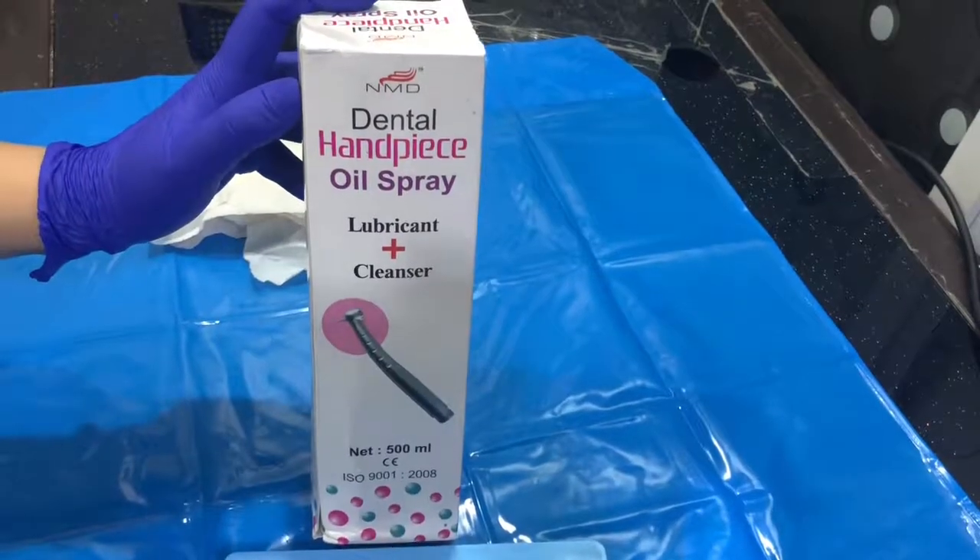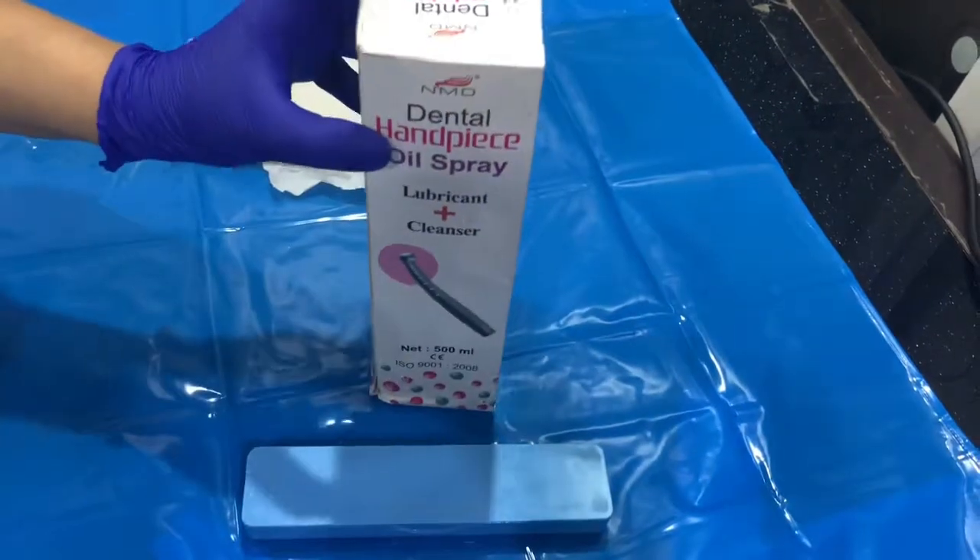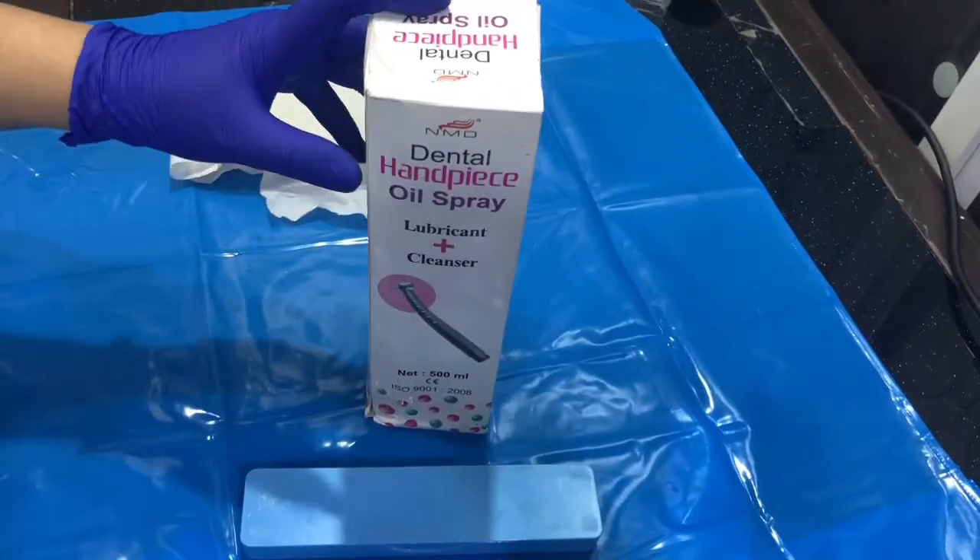This is Dental Handpiece Oil Spray from Nexus Menodent NMD. This is basically used for lubricating or oiling your handpieces.